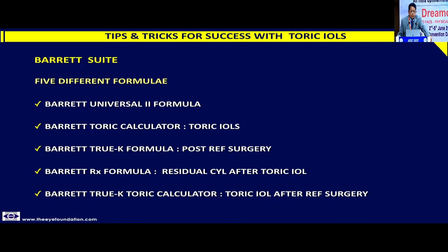Samresh already mentioned this suite of formulas. Multiple excellent formulas are available, but I can't give you all the options and ask you to choose. Basically, for about the last half a dozen years, we have stuck to this single suite of formulas: the Barrett Universal 2 formula, which gives us the spherical value; the Barrett toric calculator for toric intraocular lenses; the True K for post-refractive surgery; the Barrett RX formula whenever there is a residual cylinder after toric intraocular lens implantation; and a toric True K calculator in case I need a toric IOL after refractive surgery.